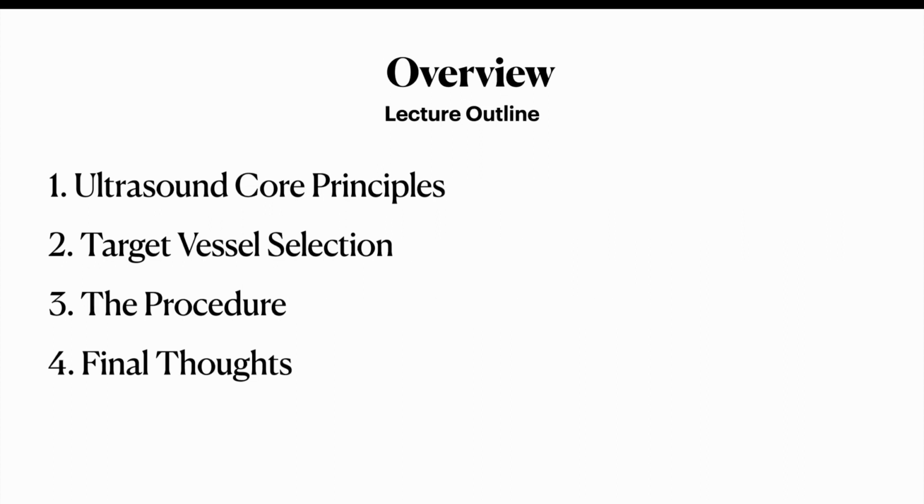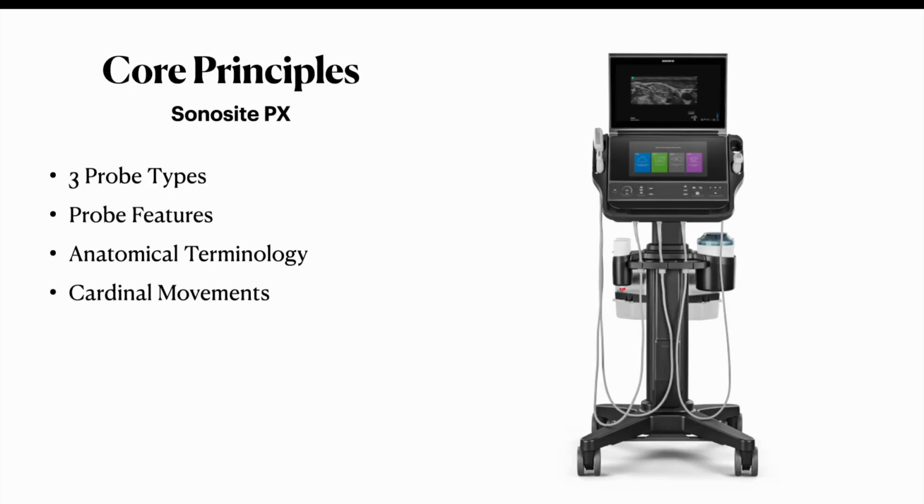This lecture will be broken down into 4 main parts. We will briefly cover a few core principles that you will need to know to perform this procedure. We will then develop an approach to identify a good target vein for IV cannulation. We will cover the procedure itself, and then conclude with just a few final thoughts. On to the ultrasound core principles.